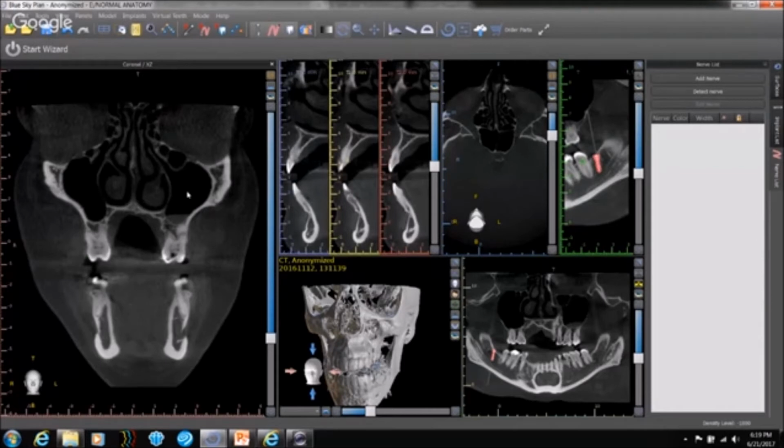So there are two schools of thought when it comes to the patency of the ostium. There's a group that believes that the patency of the ostium may not affect any implant treatment as such. If there is an infection, there is an infection, but it does not affect implants at all. Whereas there's another school of thought that believes that it does matter. So it is up to you the way you want to perceive it. That's fine. I'll let you be the better judge for that.